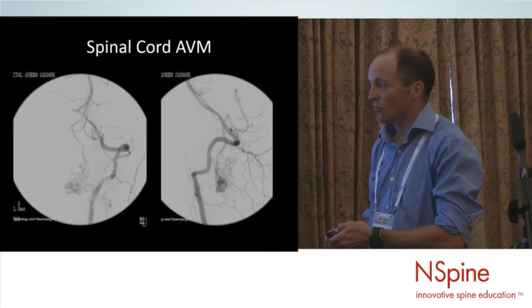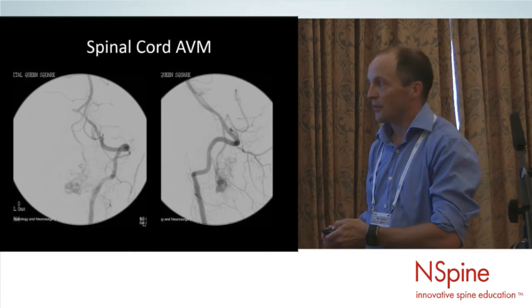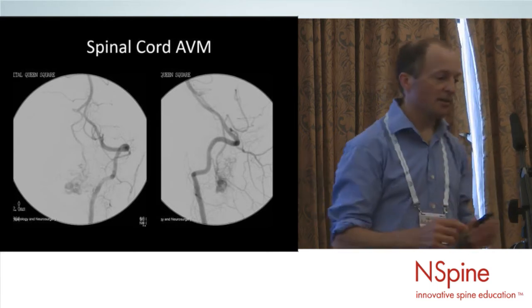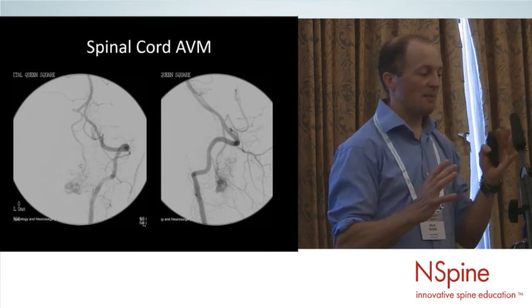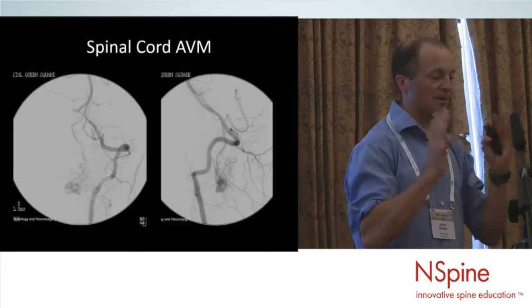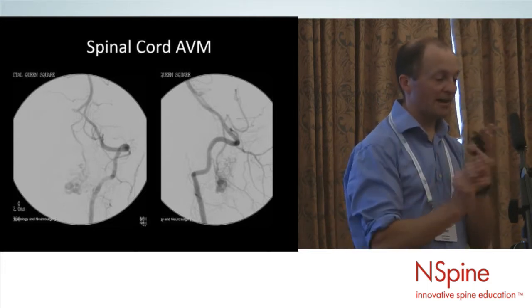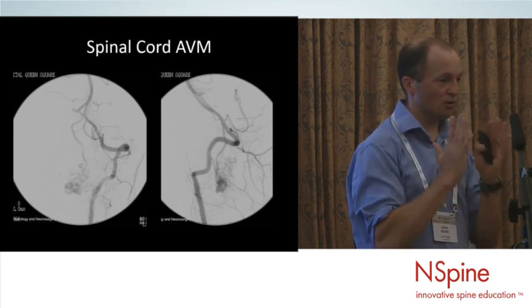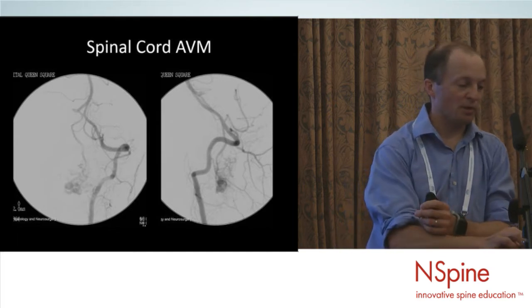This has got more of the varicosity of arterialized aneurysms at the base of the nidus that I showed on the MR, and that's filling from the other side, indicating that it's very important to be very meticulous in the angiography. I've moved the projection here, but keeping the projection as similar as possible and injecting all the arteries so you can add up which vessel is going where and very clearly define which is the anterospinal, which is posterospinal contributions, where the anterospinal axis might be above and below.